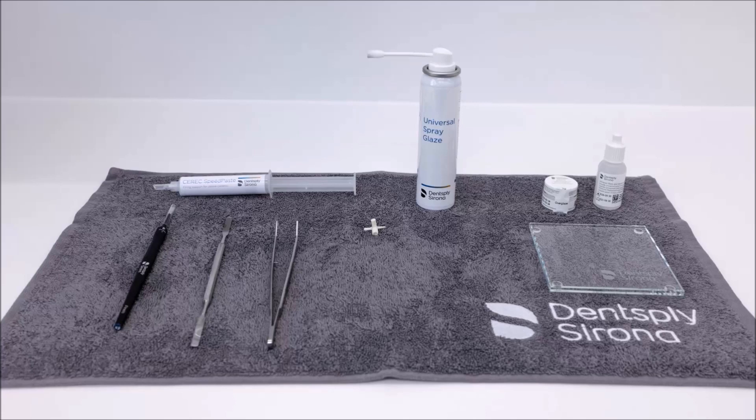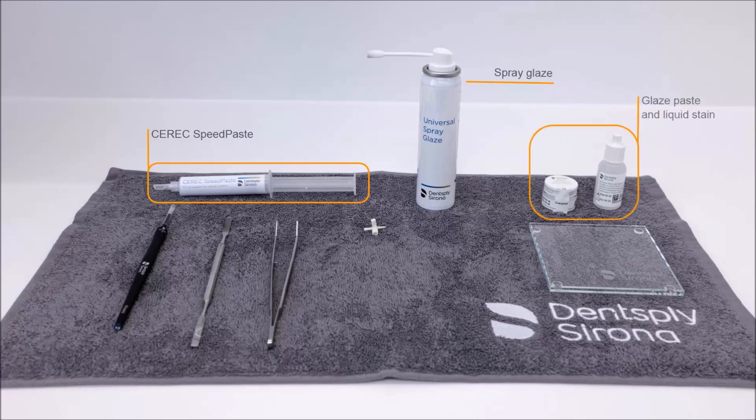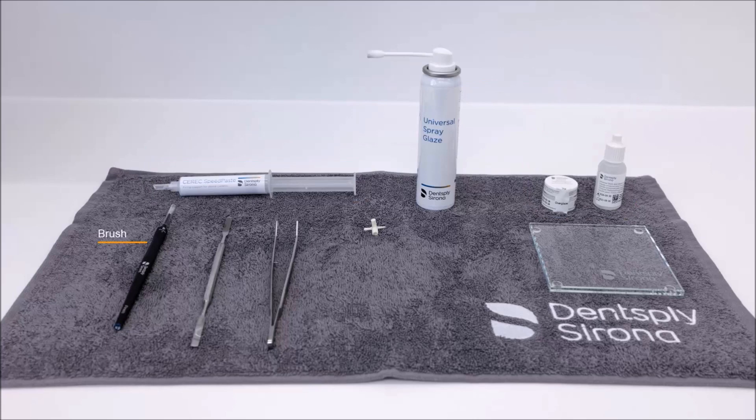This illustration shows the CEREC Speed Paste Firing Paste, Dentsply Sirona Spray Glaze, Dentsply Sirona Glaze Paste and Liquid Stain, the Dentsply Sirona Brush, a spatula, a tweezer, a mixing tray, as well as a suitable firing pin.